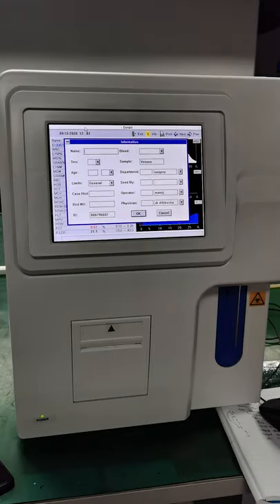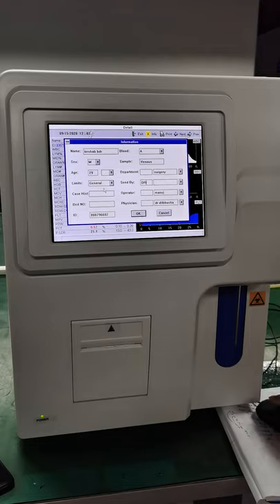And then here you can add the information about this patient. Let's say the name of the patient is Keshav and blood type is, let's say, A. Sex is, let's say, male, and age, let's say, 29. Okay, sent by, let's say, sent by Dr. somebody else. Limits general, it's okay. Department, let's say internal medicine. Case history, it's again, let's say fever. Operator, and bed number, let's say 1, 2, 3.